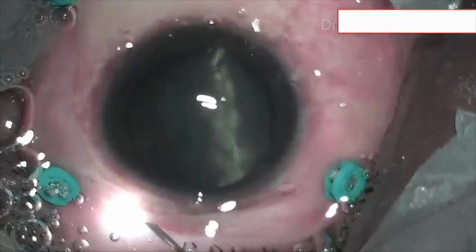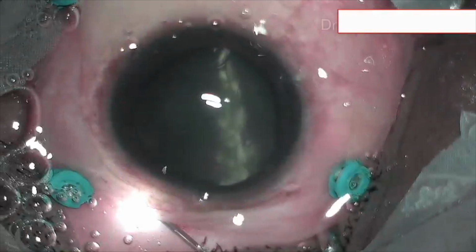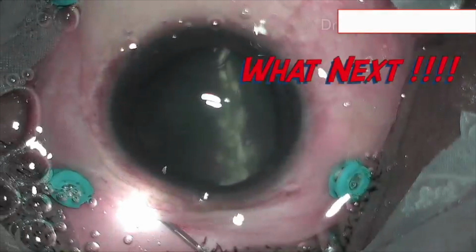I completed the laser. All I was left with was silicone oil injection. Then when I was about to inject the oil, darkness descended. I was petrified and totally perplexed. I switched on the microscope light and found a complete apposition of opposite retina due to kissing choroidals. The vitreous cavity was absolutely obliterated.